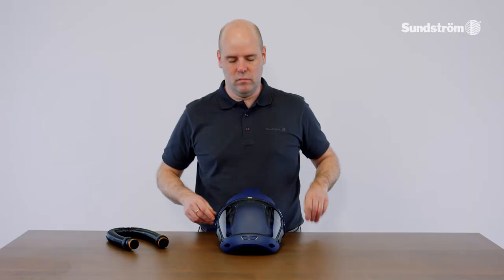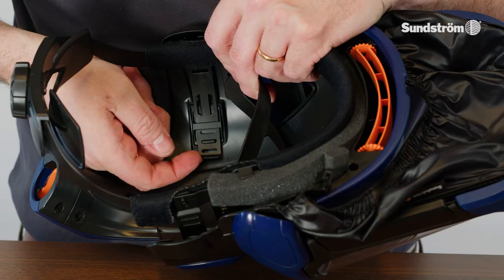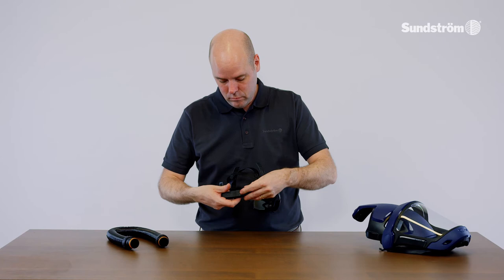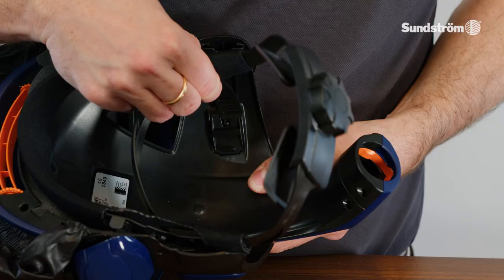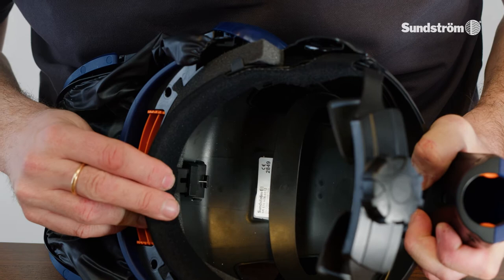Change the head harness. Remove the head harness from the face shield by releasing the three fixing points. Secure both fixing points of the head harness on the sides. Secure the fixing point of the head harness in the front.